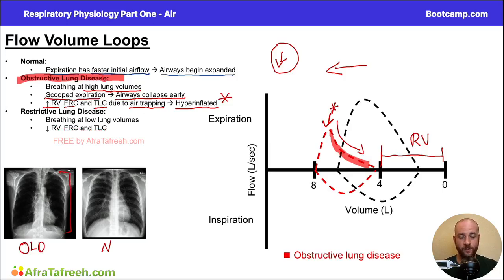And the second thing would be that on normal chest x-ray, we normally see these lung markings here, and that represents lung tissue, and that's because the amount of tissue present compared to the amount of air present is normal, whereas in a lung that is hyperinflated, we see a lot of just this black space here, which just represents air, and that's because there's a lot more air compared to lung tissue than normal.